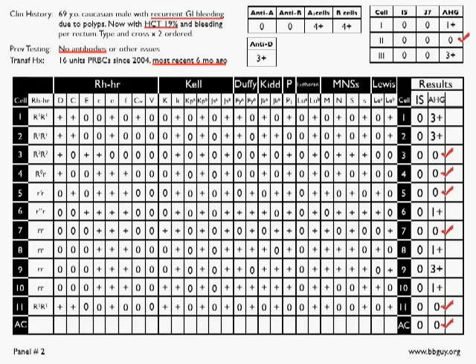Okay, moving on to the serologic information, we've got an individual who has no ABO discrepancy, who you would interpret the forward and reverse as O, and the Rh typing is positive. I'm sorry, I said A, didn't I? As O, this individual is O positive.